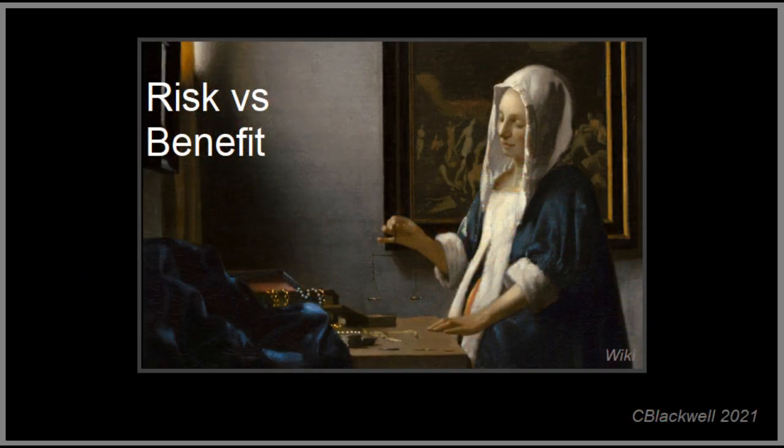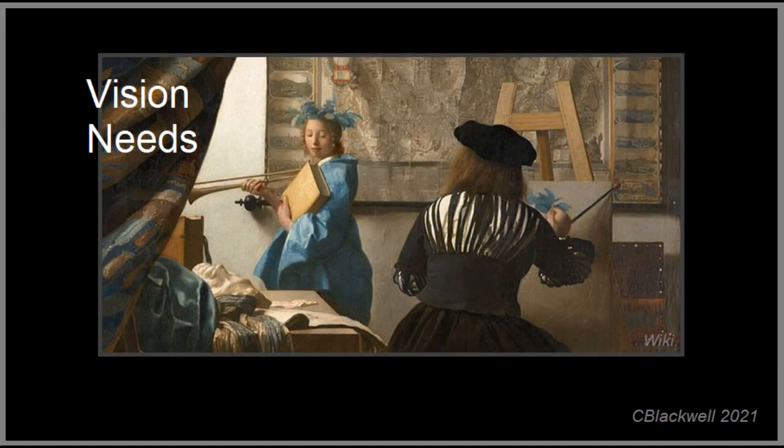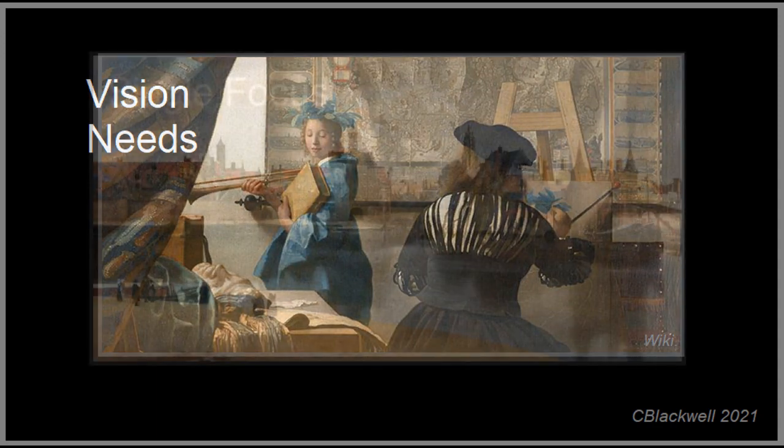It is important to realize that cataract surgery, like any surgery, carries risk of complications, including vision loss. They are uncommon, but a big deal if they happen to you, so think carefully about the risk versus the benefit. If you decide to proceed, then there is a lens to be chosen. You need to decide how much of a priority is freedom from glasses. Are there special occupational or hobby needs? Do you do regular night driving or other night vision activities?